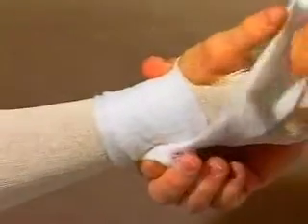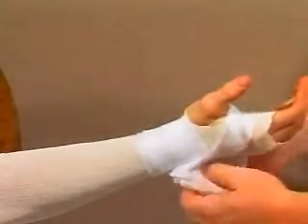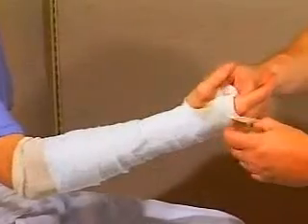Wrap the cast padding onto the limb, starting distally. Avoid wrinkling by stretching or partially tearing material to lay down smoothly. Extend it proximally, overlapping the previous layer by two thirds so that there is at least three layers thickness throughout. Extra padding is required at the ends and bony prominences. The initial layers can be turned down at appropriate landmarks.